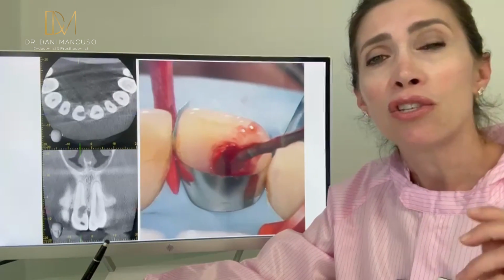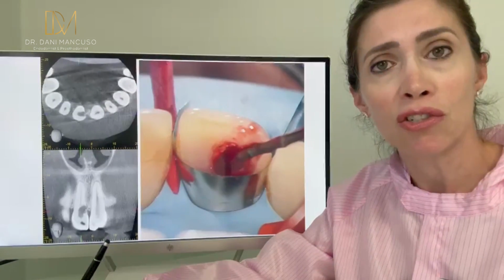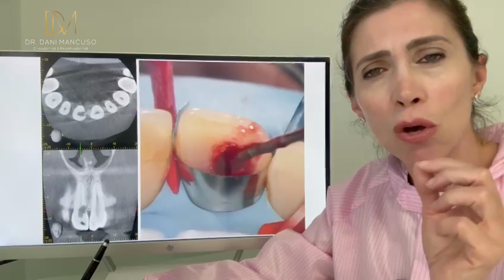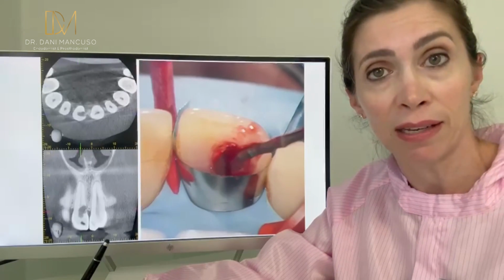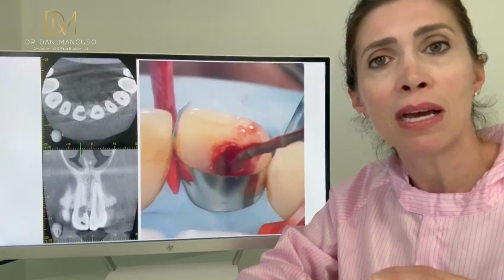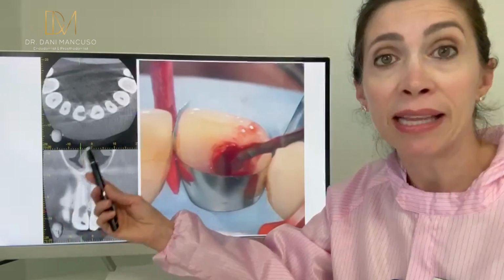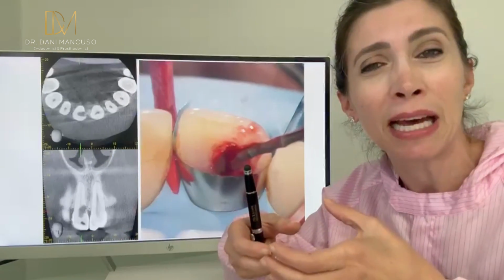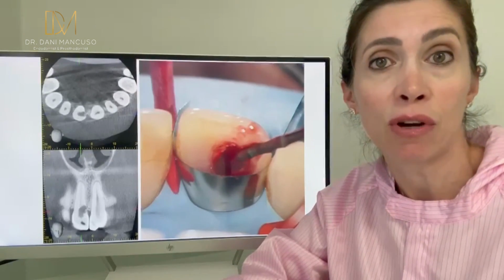So I would say just be gentle, remove the granulation tissue. As soon as you remove that granulation tissue, the bleeding will stop. Or if it doesn't stop completely, it will just be so mild that with your magnification, you will be able to go in there and just block that. You can use a hot tip and just cauterize that area to stop bleeding so you can work. When you access and see how big that external cervical resorption is on the outside, like how big that hole is, then you will judge how you are going to restore that tooth and if you are going to restore that tooth.